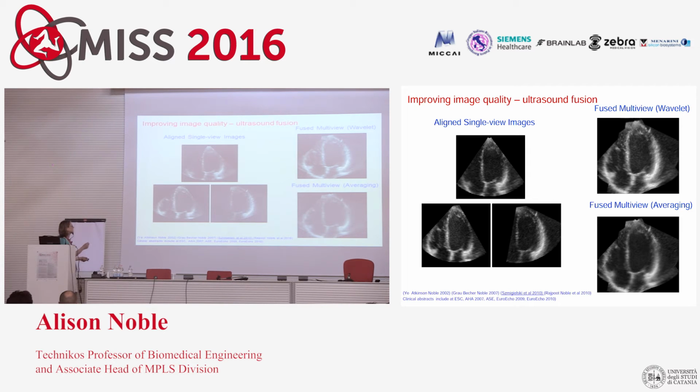What sonographers do is they move the probe around a small amount before they press the button and save the data. And if they do that, they seem to do a very good interpretation. So from that observation, my conclusion was, well, why are we making computers only work with one data set, the final one? Why are we not letting the computers work with the few data sets before that? And at the time, because there was a lot of work on registration, that led us to look at how we could do ultrasound fusion.